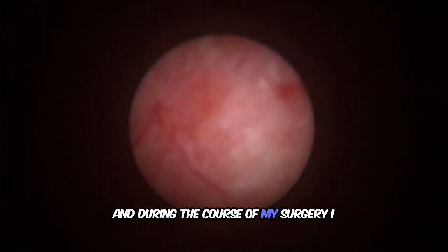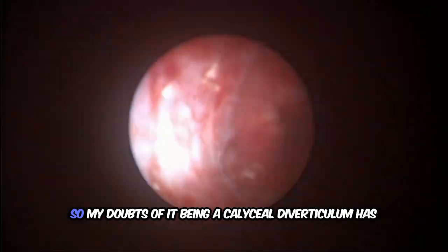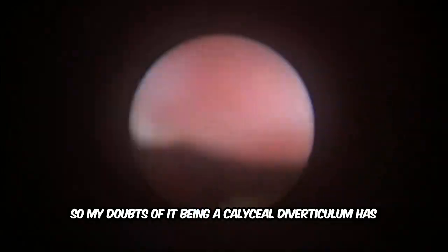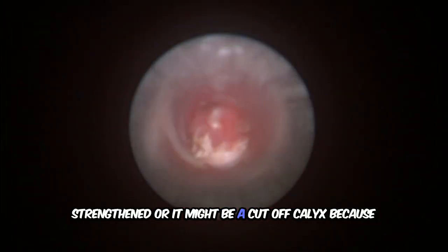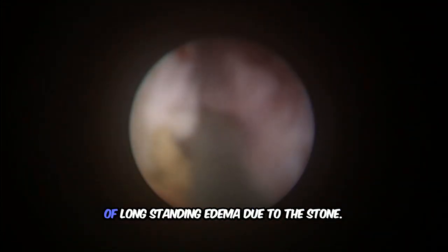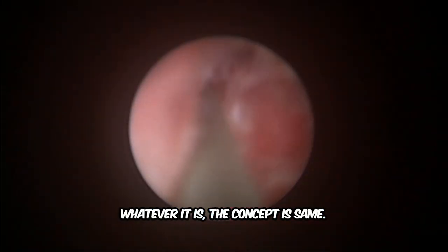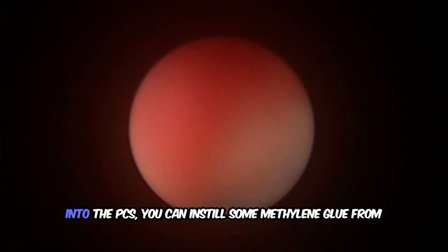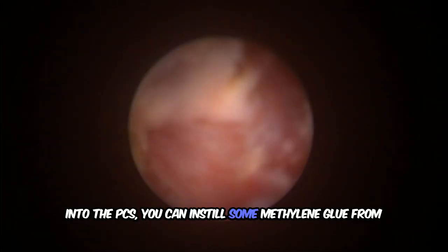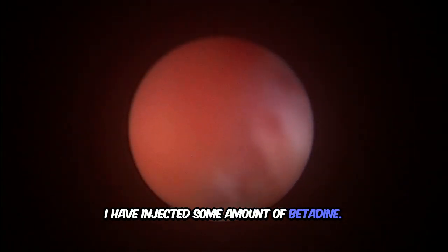and during the course of my surgery, I could not see the ureteric catheter also. So my doubt of it being a calyceal diverticulum strengthened, or it might be a cut-off calyx because of long-standing edema due to the stone. Whatever it is, the concept is the same. If you are not able to find the access into the PCS, you can instill some methylene blue from below. As I did not have sterile methylene blue, I injected some amount of betadine.